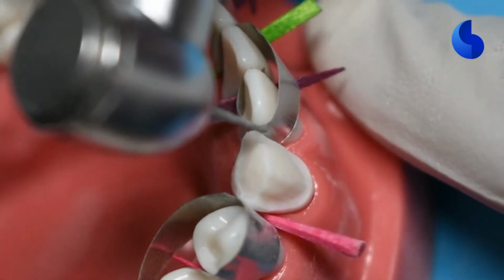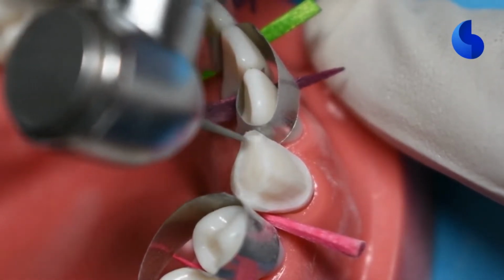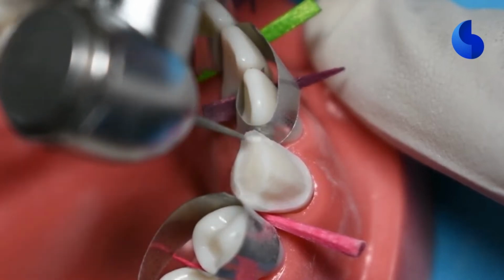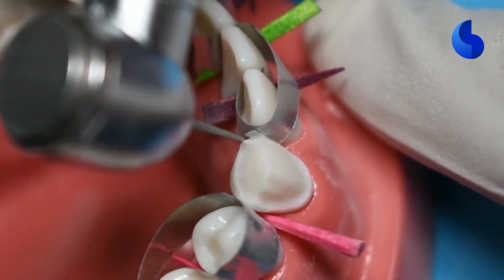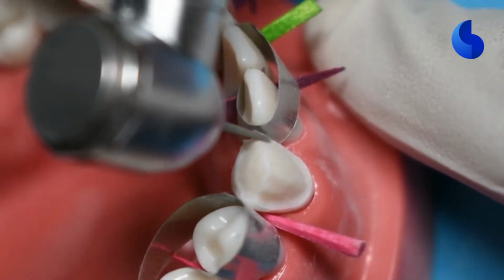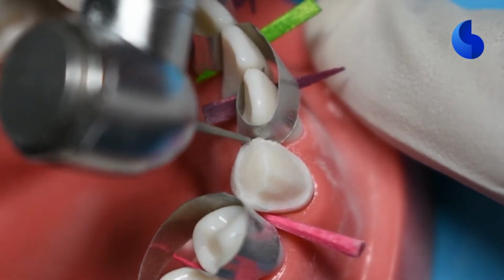Once you're done with your facial reduction and you're happy with the adequacy of it, we're looking for 1 millimeter. Now you can move on to your interproximal reduction to remove that island of tooth structure and break your contact. When you're doing this, make sure that you're protecting your adjacent tooth structure.